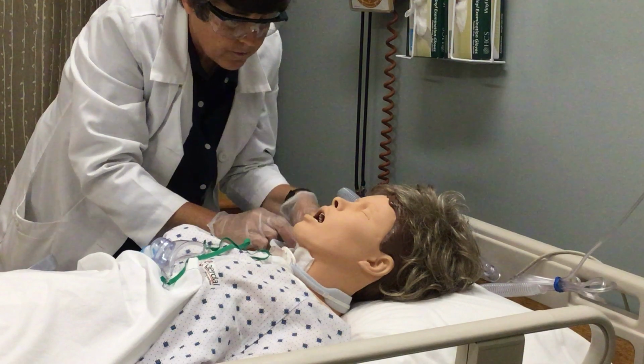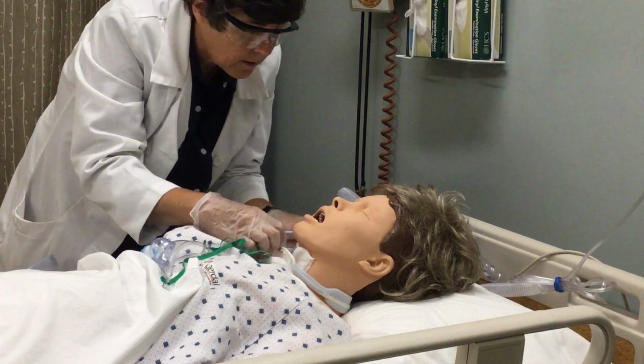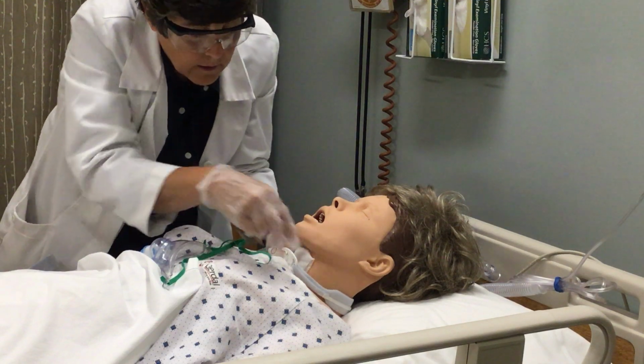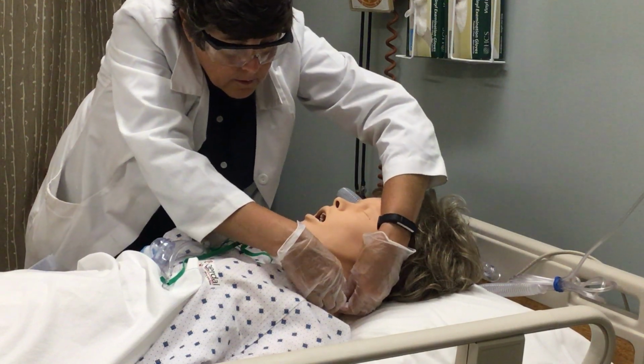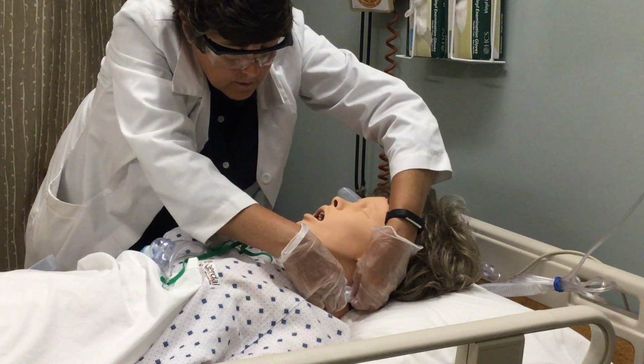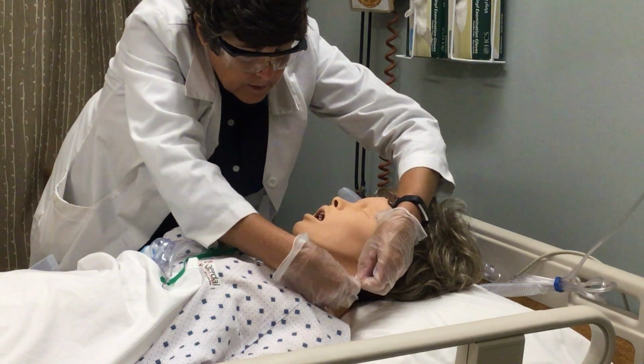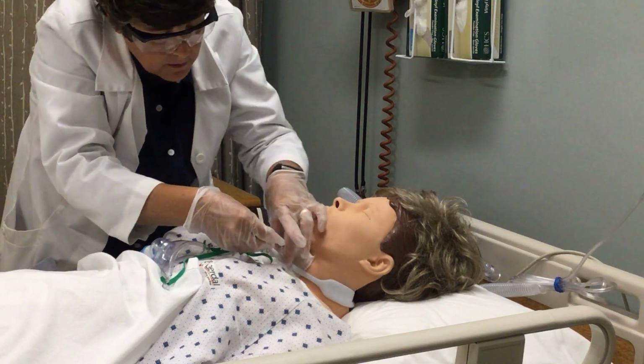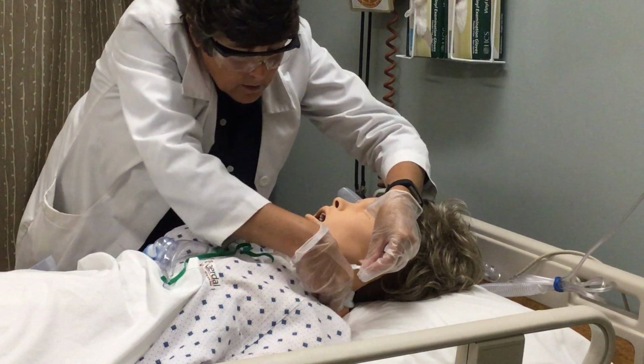You usually want to be able to get 2 fingers in between the new trach collar securement device and the patient. This one happens to be, I think, a little big for her, so I will maybe get a smaller one for her.